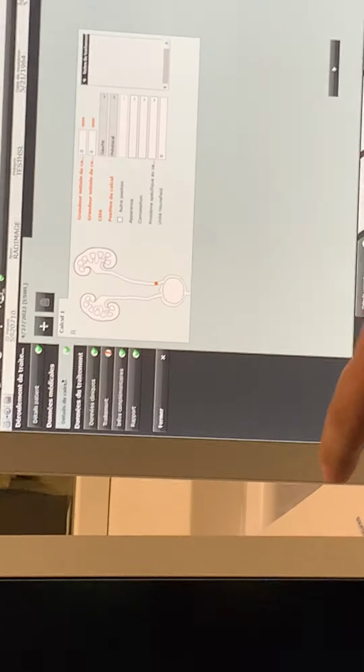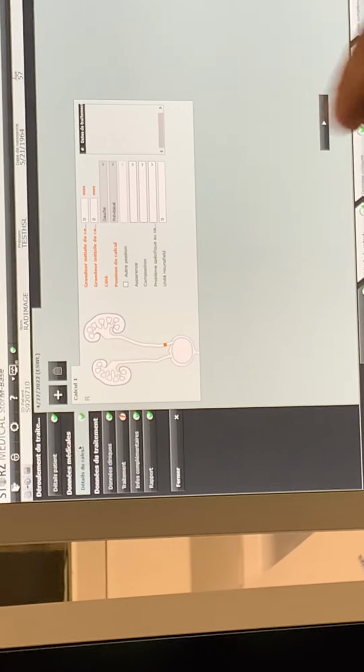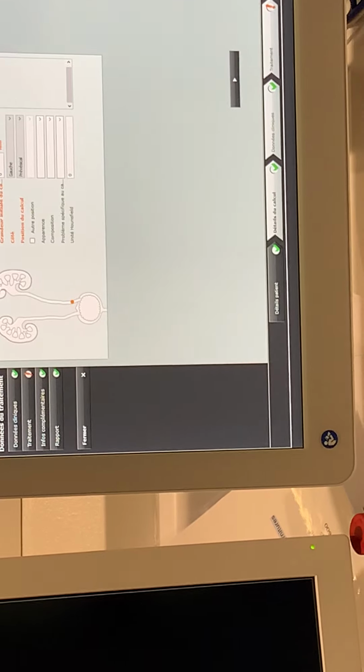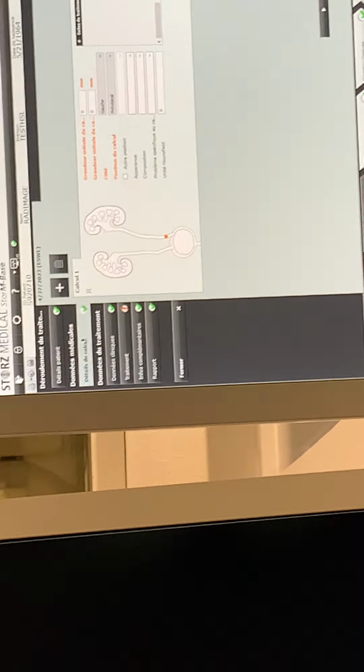These five data are mandatory to unlock our X-ray system. If you're not entering these data, you cannot unlock the X-ray system. Even though it is orange here at the stone details, it is not a must to enter the stone details.